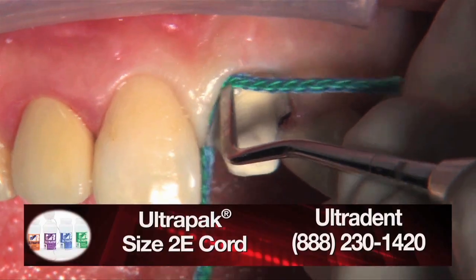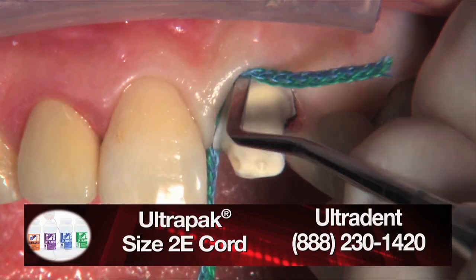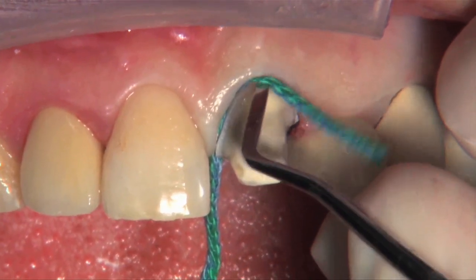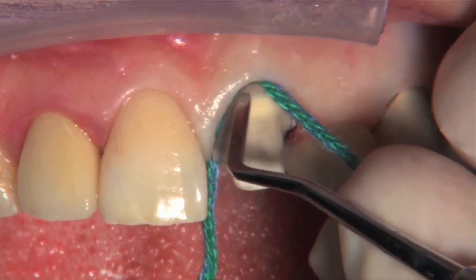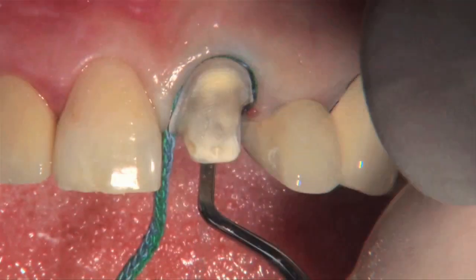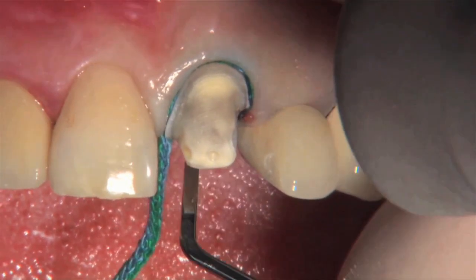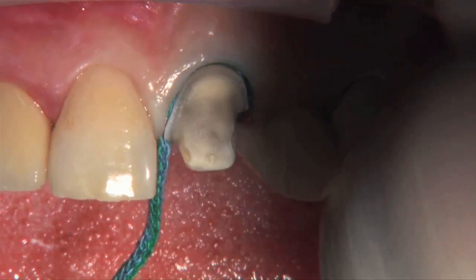Then we're going to place our top cord of the two cord technique. This is a size 2 cord, Ultrapak cord from Ultradent, and that's being placed on top of that. You really can't floss this one into place because it might disturb the double zero cord below it. If you tried to floss it in, you'd move that cord around. So typically I'll just tuck in one end interproximally as an anchor and then start there and work my way around. Again, this cord looks large, but you have to keep in mind that it's hollow. So as you press it down and pack it in, it collapses into the sulcus and then sits and regains its shape once it's in the sulcus again.